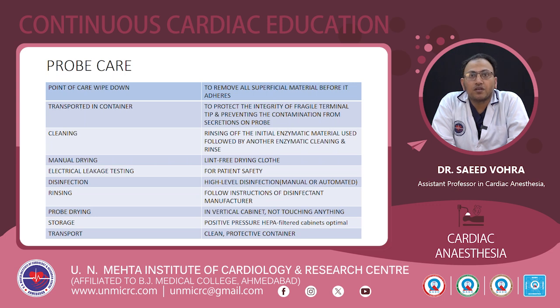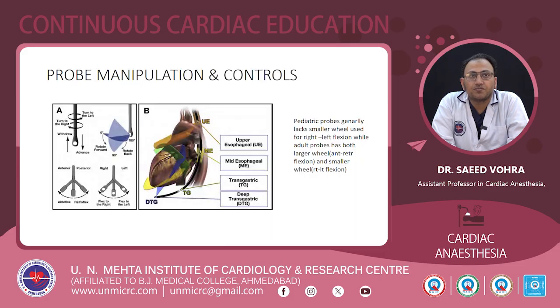Probe drying is to be done in a vertical cabinet, not touching anything. Storage is done in a HEPA filter cabinet; optimal is a positive pressure HEPA filter cabinet. Transportation: a clean and protective container is to be used.